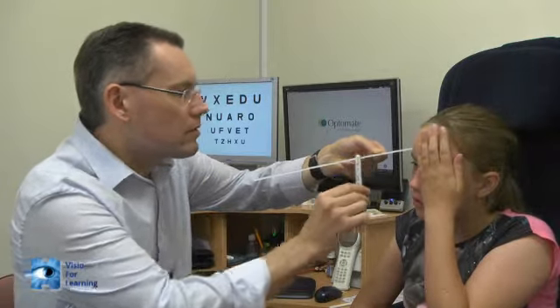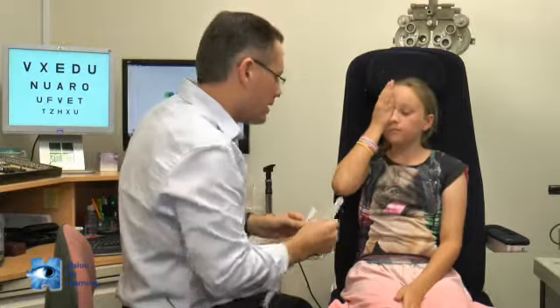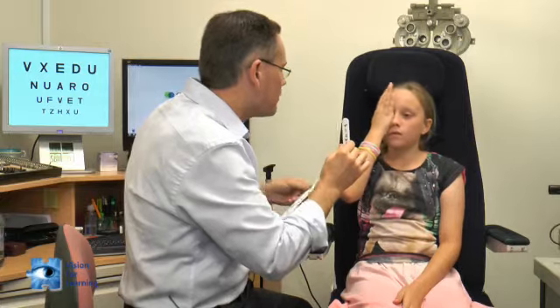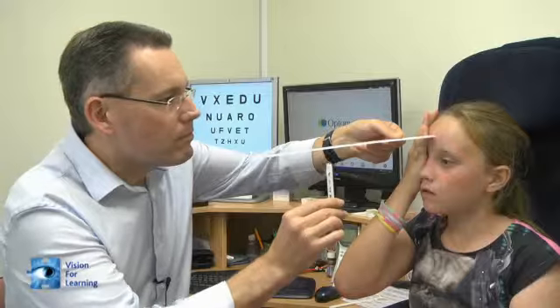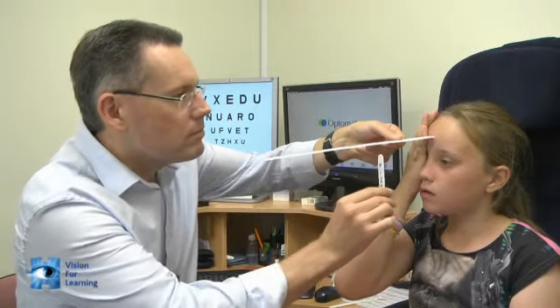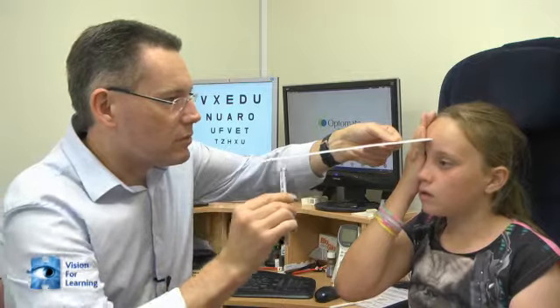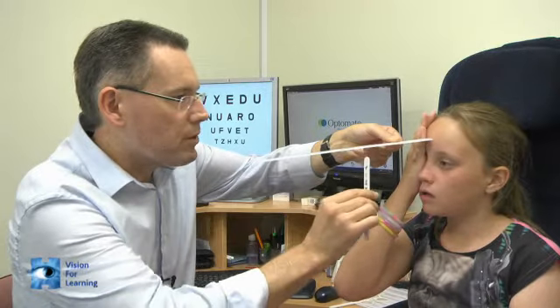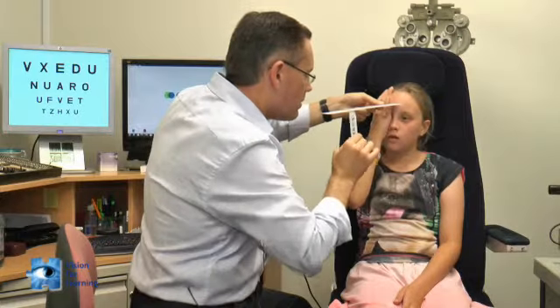Now. Great. If you can swap over and cover the right eye. Again, I want you to look at these letters. Tell me when you first notice them going blurry. Now. And again, when you first notice them going blurry. Still good? Now. And again.